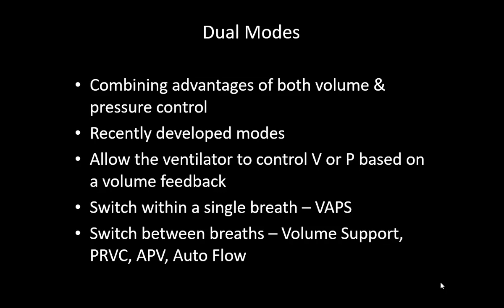Coming to another entity, dual modes. What do we mean by dual modes? Where we combine the advantages of volume control as well as pressure control. So what are the advantages of volume control? We can control the volume, we can deliver the set tidal volume. And what are the advantages of pressure control mode?